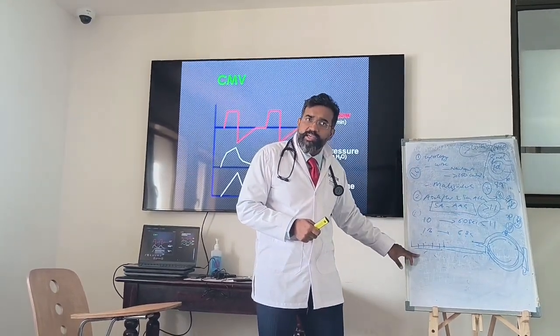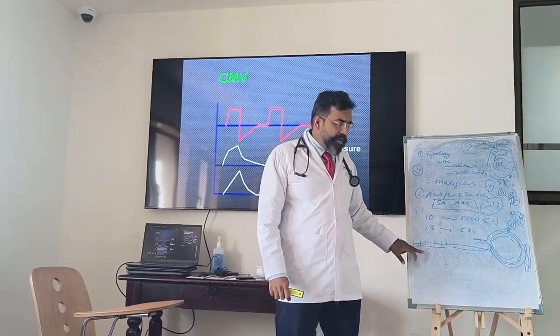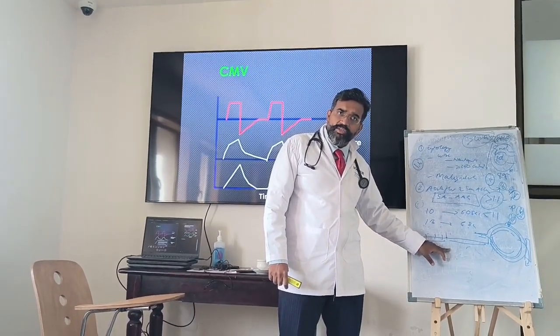अगर मैंने 1:2 सेट किया तो कितना हो गया? 2 seconds inspiration, 4 seconds expiration. Breath cycle 2 seconds, 4 seconds हो गया. Clear? 2 seconds and 4 seconds. You are clear on this till now?